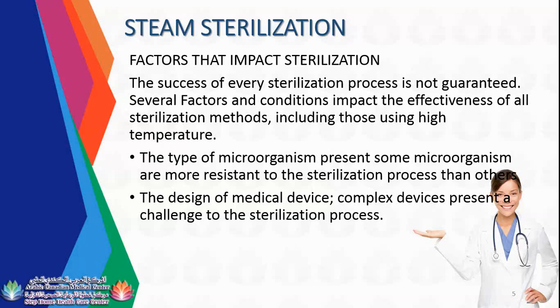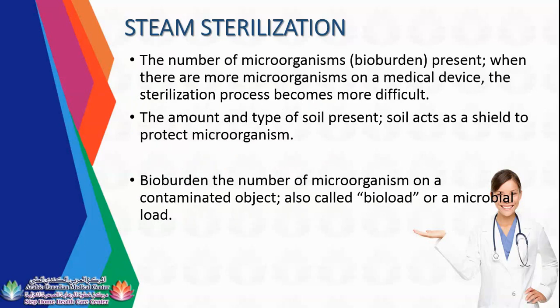So the type of microorganism present, some microorganisms are more resistant to the sterilization process than others. The design of medical device, complex devices, present a challenge to sterilization process. So that's why you are using also helix test to check for those porous instruments or hollow instruments. The number of microorganism bioburden present, when there are more microorganism on a medical device, the sterilization process becomes more difficult.